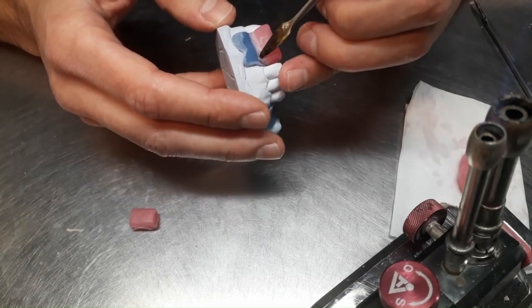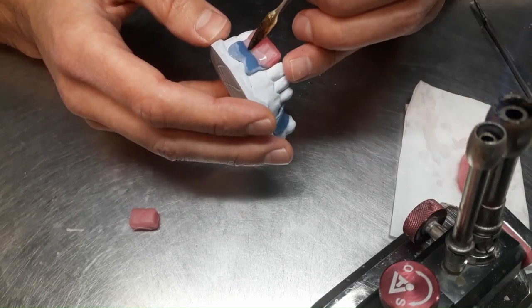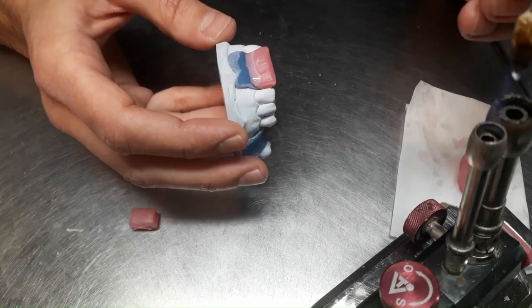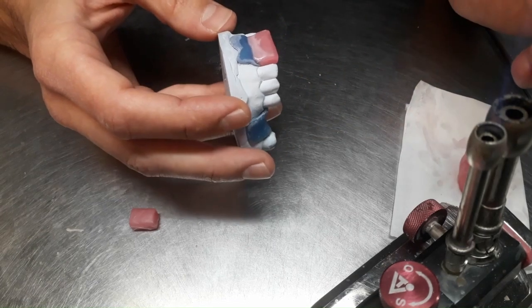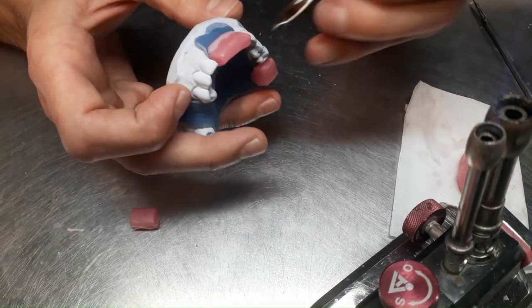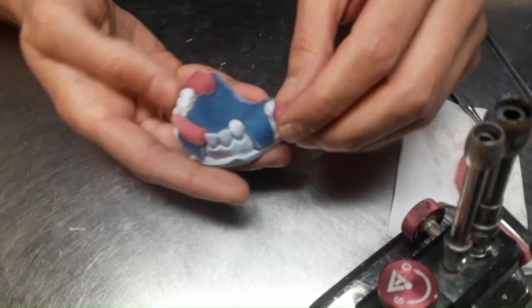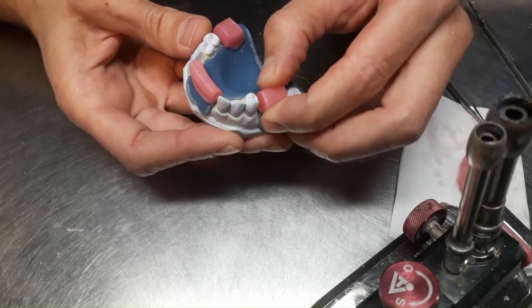On this one, the dentist will also mark the midline, the vertical, the smile line, and if canines are missing, the line of the canines corresponding to the wing of the nose and the buccal commissures. The lips commissures, the junction of the two lips, upper and lower.